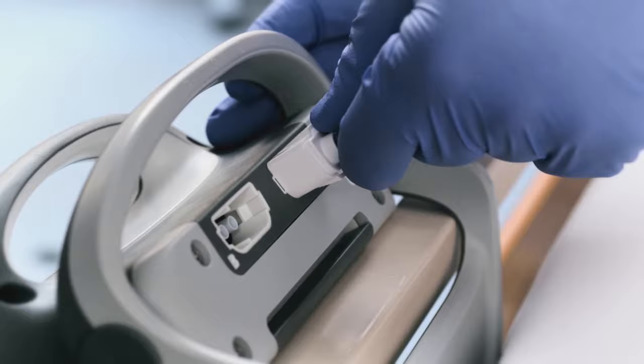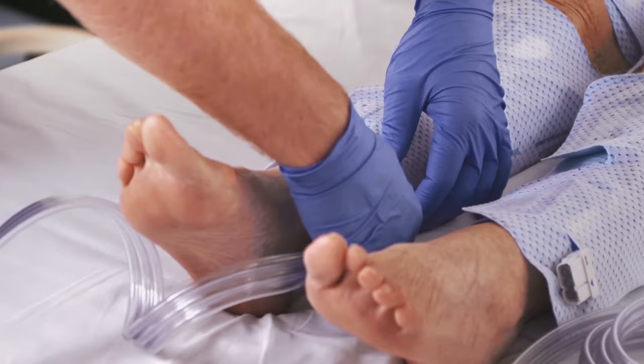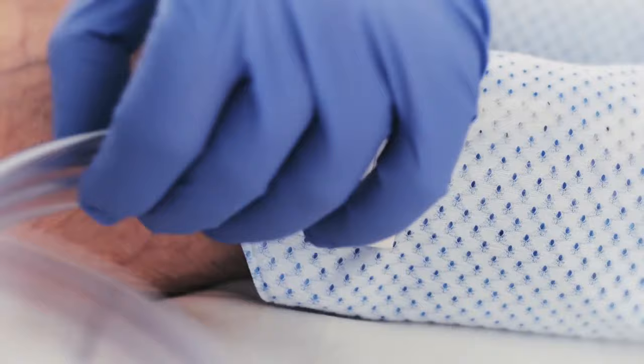Plug the tubing sets into the back of the controller and then route the tubing towards the patient's limbs, being careful to leave access ways clear and eliminate tripping hazards. Plug the tubes into the sleeves, checking for kinks and ensuring a secure attachment.